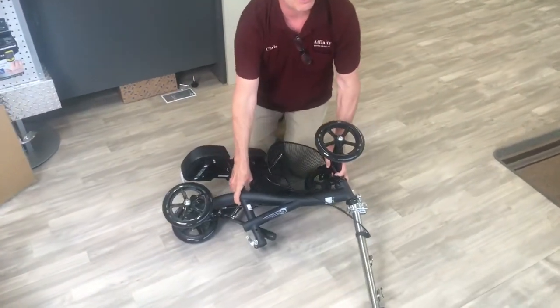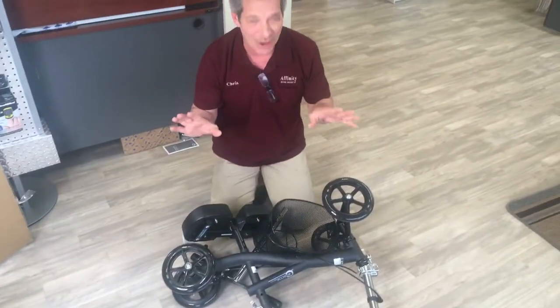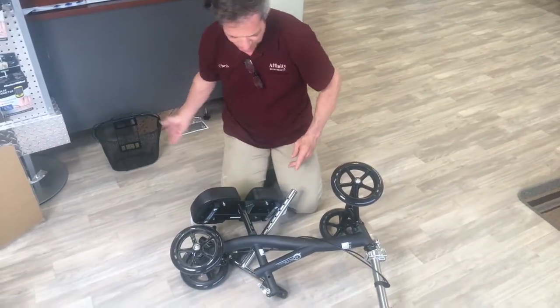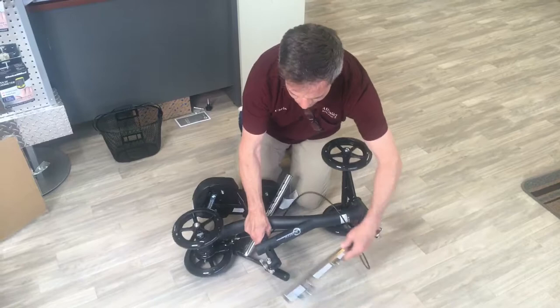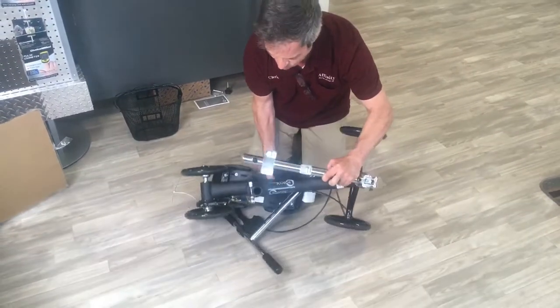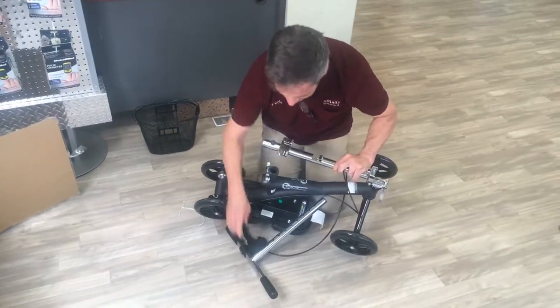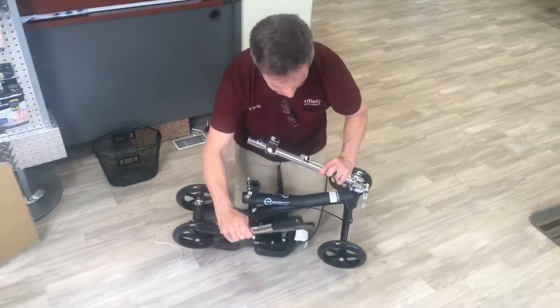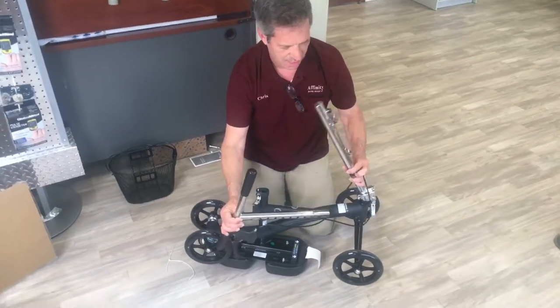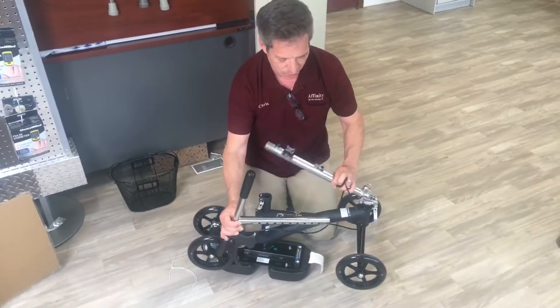We wanted to do a video to show you it's really not that hard. Here's what you want to do: just set your basket aside like so, and realize that the seat is on the bottom initially. We'll leave the seat down there for now. The other components you can see are your handlebar, which is not yet assembled, and the folding mechanism for the knee scooter.